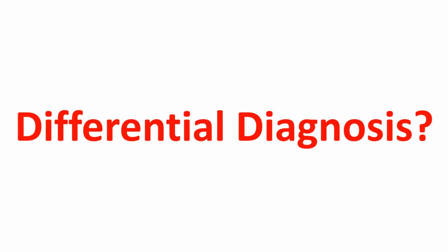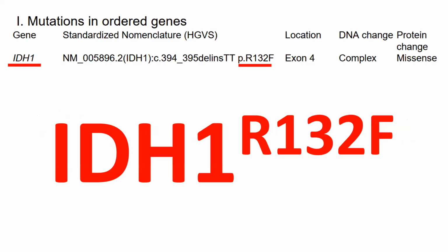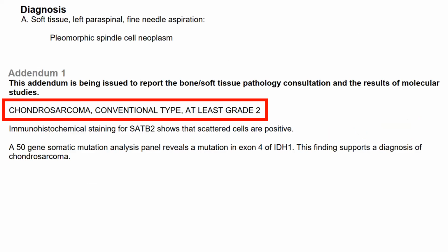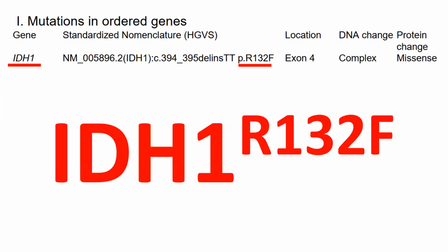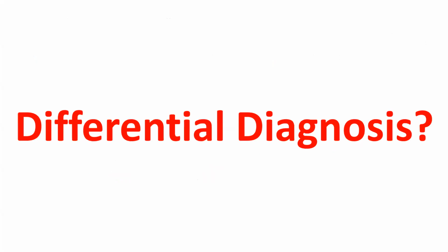The answer to the question is yes, it just changed big time. Would you like to see it again? Okay, this is chondrosarcoma. How did you know, maybe not absolutely, but strongly suspect, that this was not a glioma, that it was chondrosarcoma? How could you possibly know that? It's the granularity. It's your knowledge base. How deep or superficial is your knowledge base? The answer is right here.